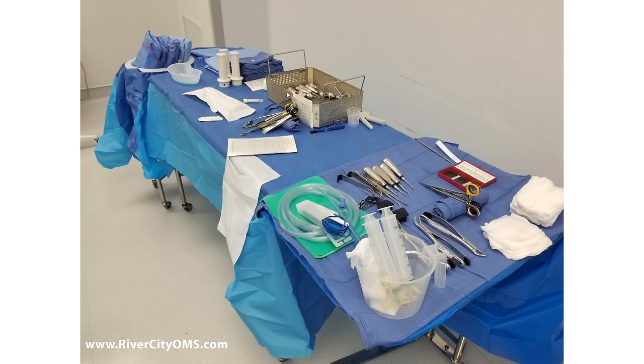That's a suture laying there. This is a culture tube. Not sure what that is right there. It's turned over so we can't see what's inside the package. Here's some gloves, size 8.5. Thank you very much. Here's another glove back here.